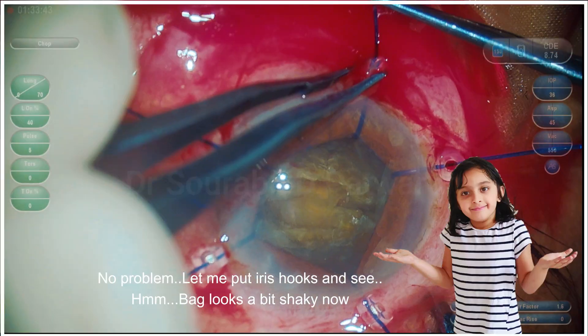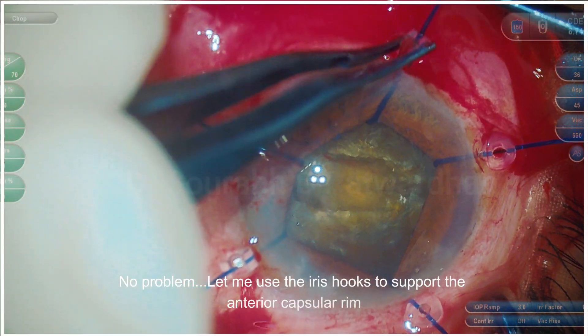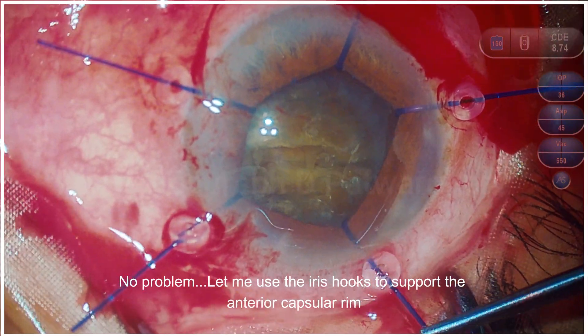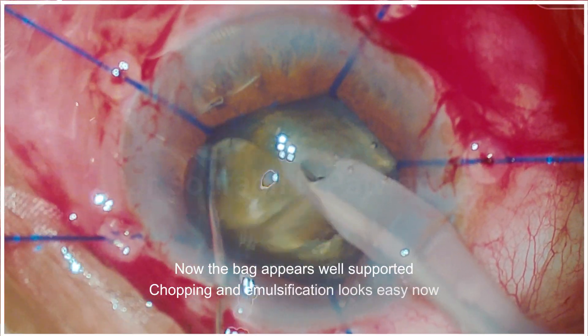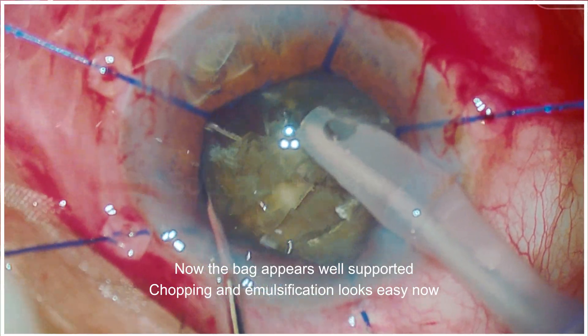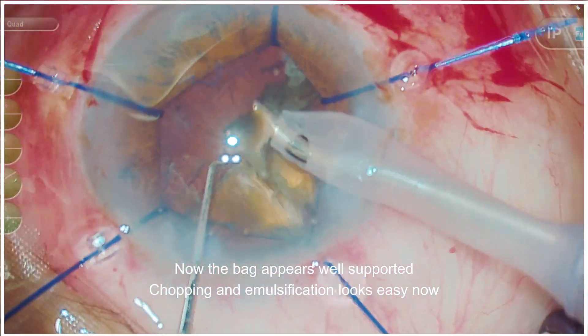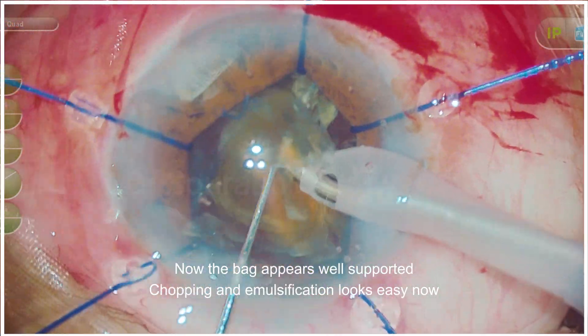Now the bag looks a little shaky. I already have iris hooks there, so I just use the same iris hooks to support the anterior capsular rim. Now the support appears good, and the chopping and phacoemulsification now looks quite easy.